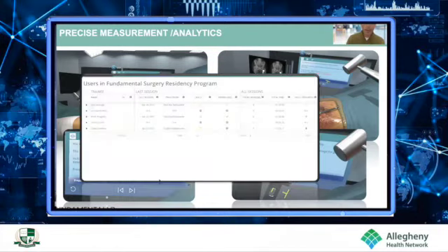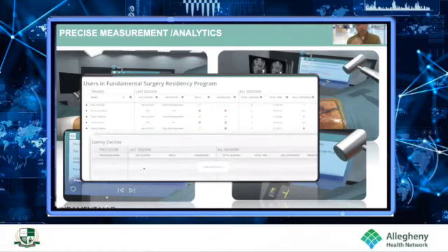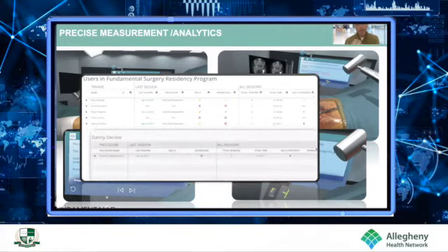And all of that then goes into a data dashboard as well that allows you to build up a profile of learning over time, which is essential as part of, again, a blended learning situation. So this is mineable data, not just usage and attendance, but also knowledge levels, skills levels, right down to one surgical objective within a very long procedure that can all be mined and understood.